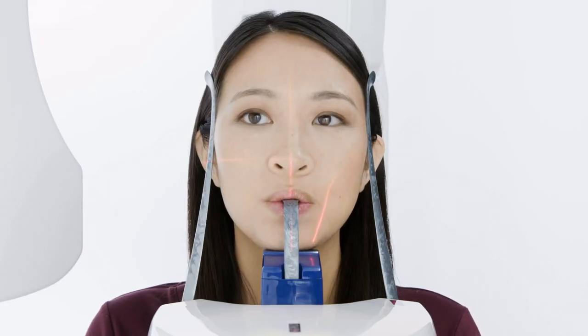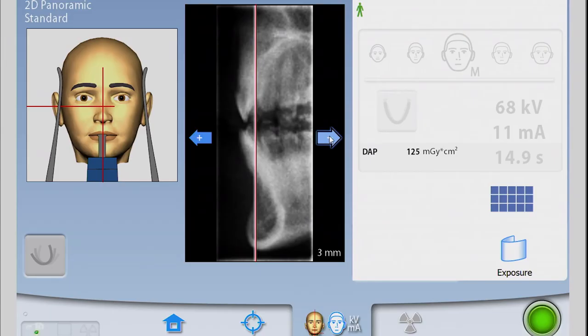Press Forward to take autofocus on the touchscreen and instruct the patient to remain still, close the lips, swallow, and suction the tongue to the roof of the mouth. Once the autofocus images appear on the touchpad, verify that the red line passes through the root tips of the central incisors.